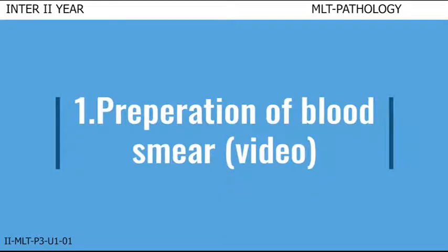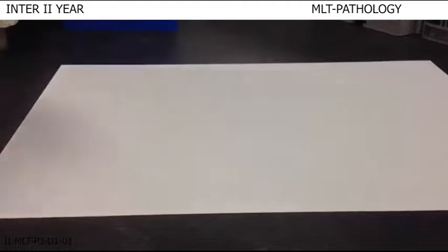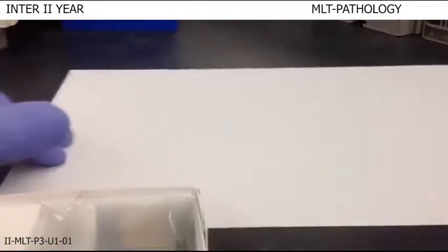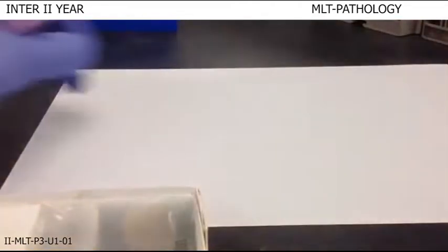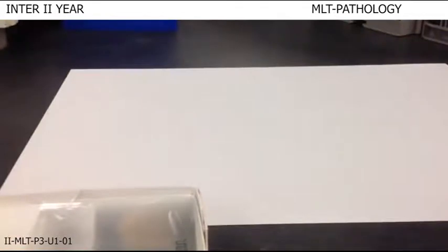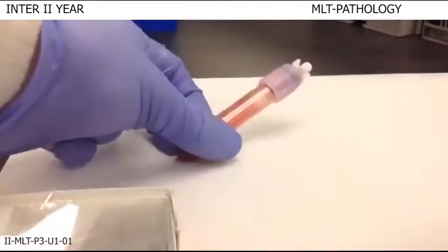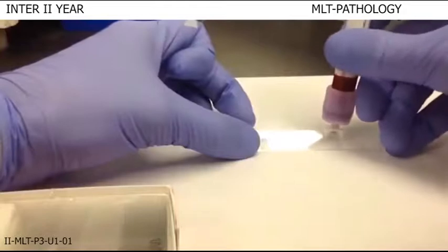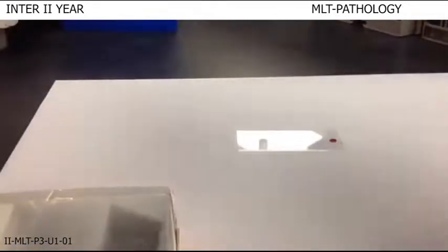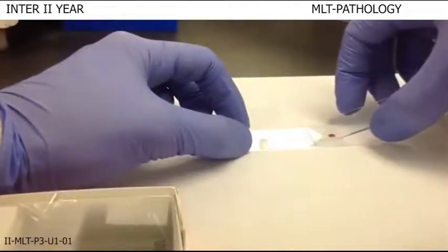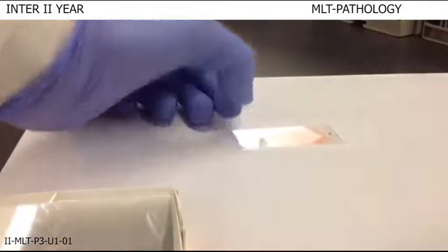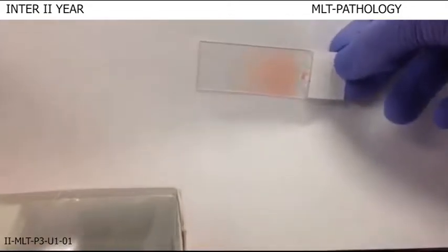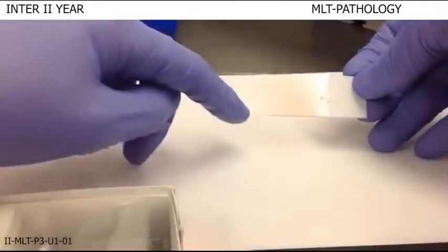Preparation of blood smear in video format. I'll show you how to make a peripheral blood smear. For this you are going to need some slides and some anticoagulated blood, preferably EDTA. I'm using a cap piercer to make the blood drop. First, install your cap piercer and get two slides out. Add a small drop of blood to the first slide. Place the second slide on top and slowly bring it back until it makes contact with the drop, and then rapidly push it forward. The smear will be about two-thirds of the way down the slide, with a nice feathered edge at the end.